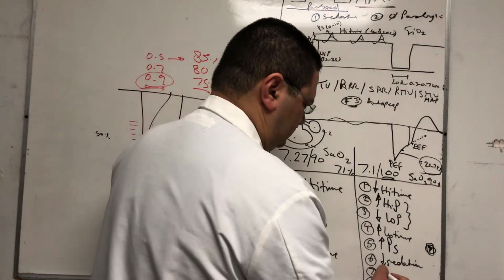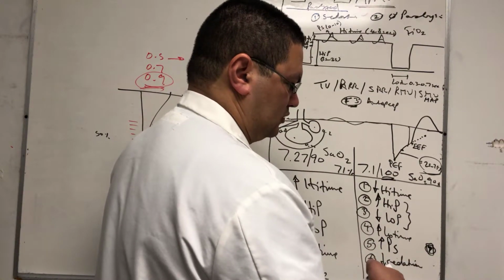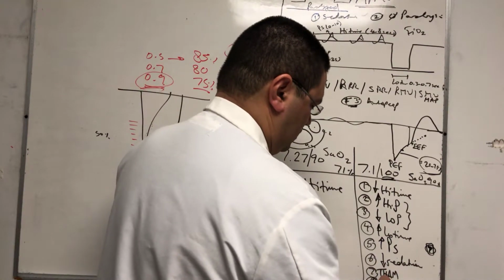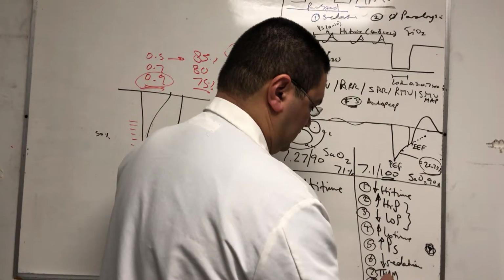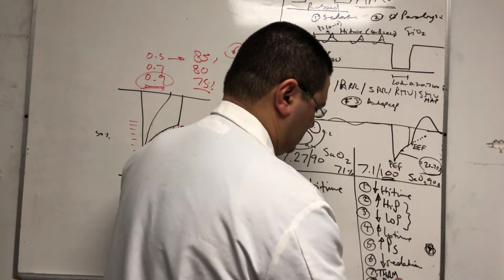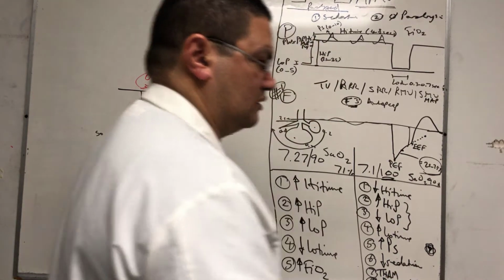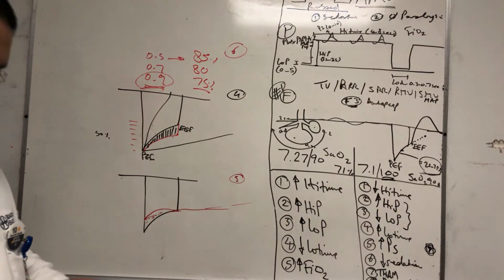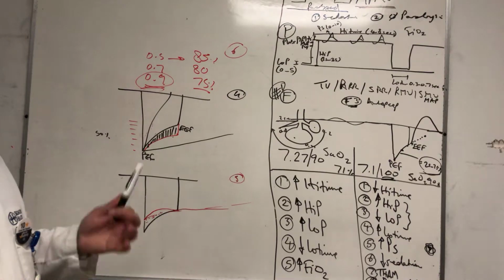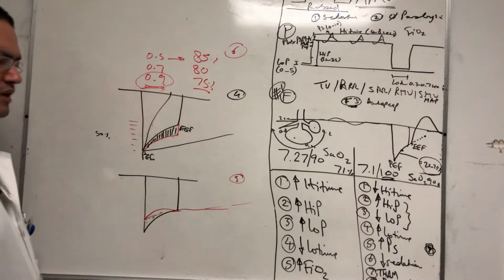The other two, I'm going to put them here not because they're specific to this mode of ventilation, but because they're used frequently in this mode of ventilation, which is THAM, which we don't have currently in the United States, but it's coming hopefully, and the removal of dead space. These two, for any mode of ventilation, will improve things. But I put those, especially THAM, because with this mode of ventilation, especially the classic APRV, you might not be happy with the acidosis part of the equation.